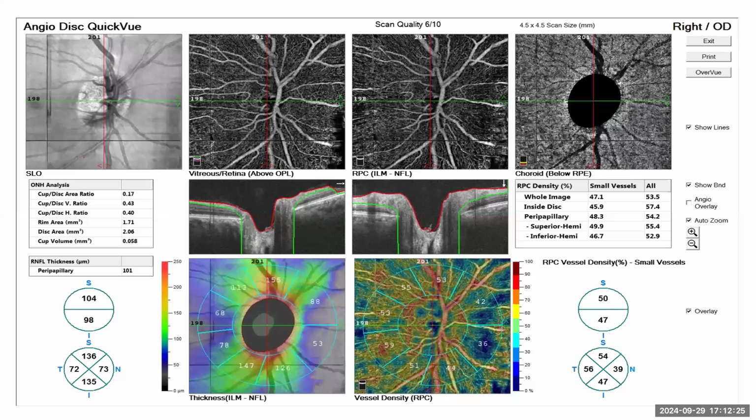If we would have medications that would increase vascular perfusion as their sole mechanism of action, then the OCTA will be able to re-image the eye and see if the vessel density improves or remains the same over a long period of time, for which you may not expect loss of nerve fiber layer and the visual field changes. Everybody may not agree, but if that happens, it will open a new frontier for glaucoma care.